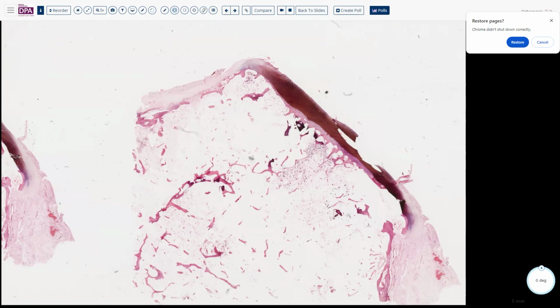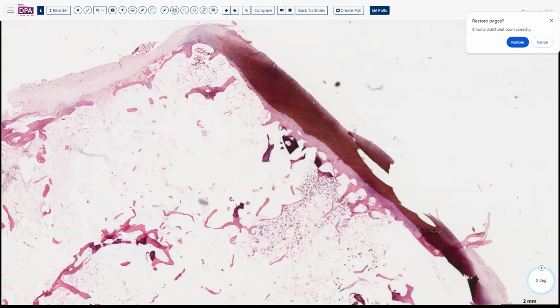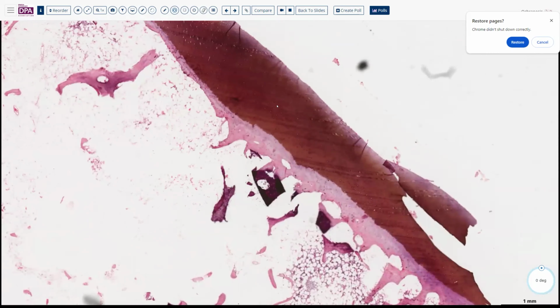I'm not aware of really anything else that quite gives you this discoloration of the articular cartilage. And as to why it's the articular cartilage, I think it may be some of the affinity with the chondroid ground substances and the metabolic byproduct.